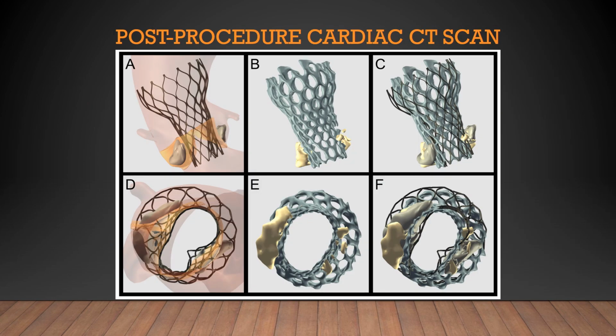Certainly post-procedure cardiac CT scanning would be very important, especially in patients where we have some concern, where there is evidence of paravalvular leak, and how the valve is sitting. Obviously the concern of radiating these patients again and again would remain, but nonetheless, at least from an academic perspective, this would allow us to evaluate these percutaneous heart valves in a nice fashion.